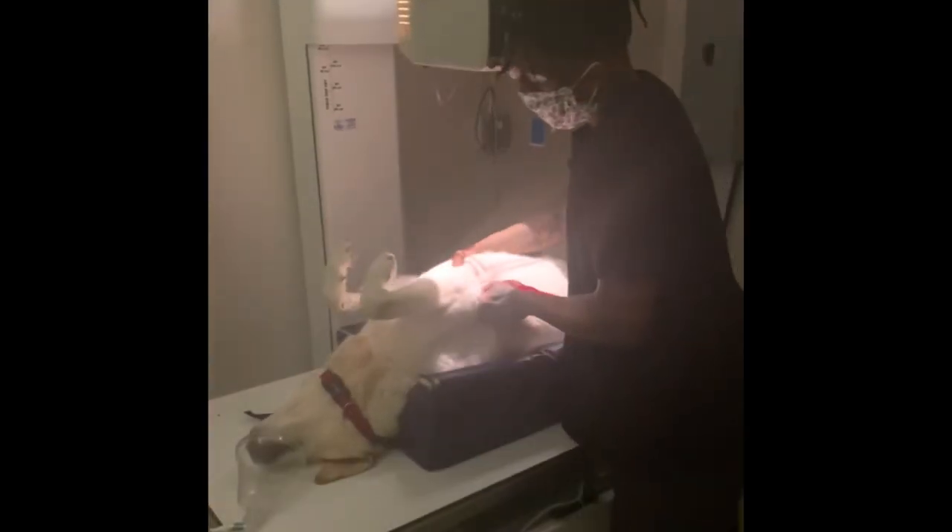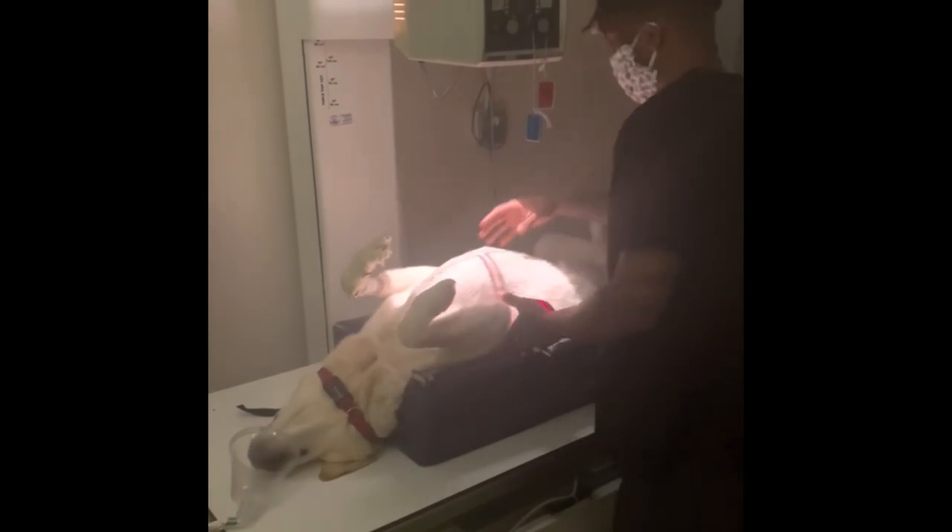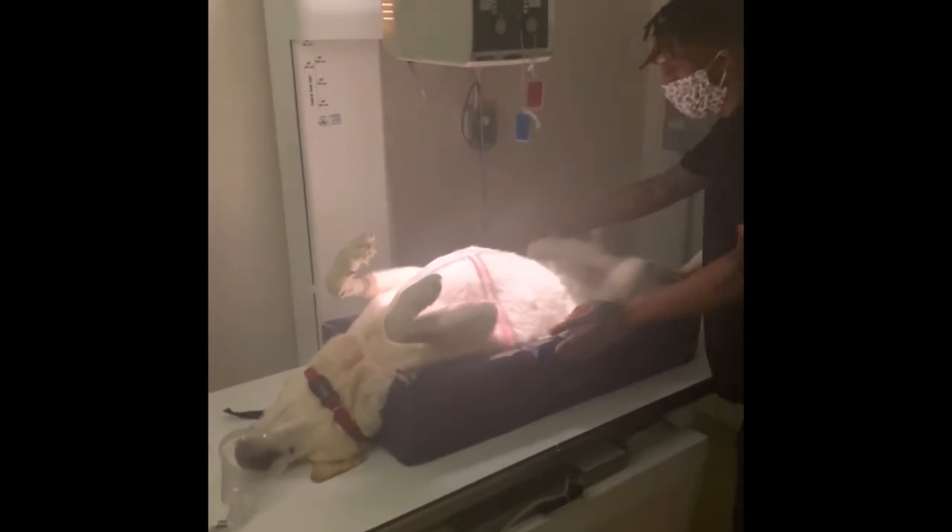This x-ray should start at the thoracic inlet, or near his neck, and end near the end of his rib cage, to ensure all of his lungs and his heart are in the image. I'll make sure to get the dog centered in the light, with the ventral line of the collimator light going down the center of his chest.